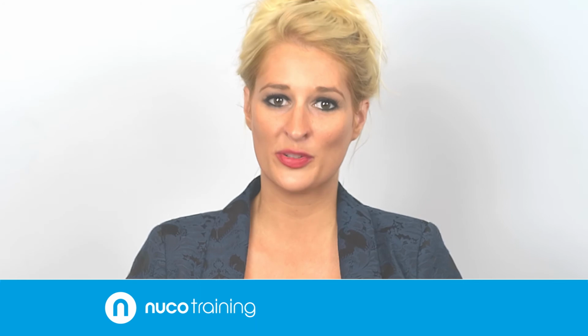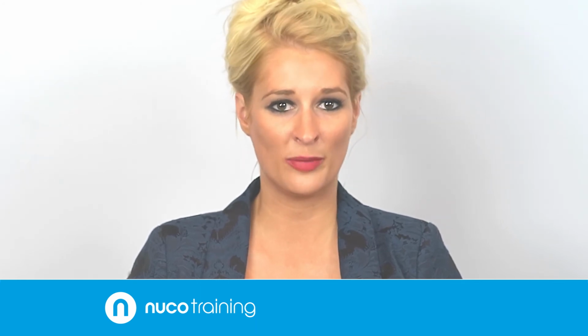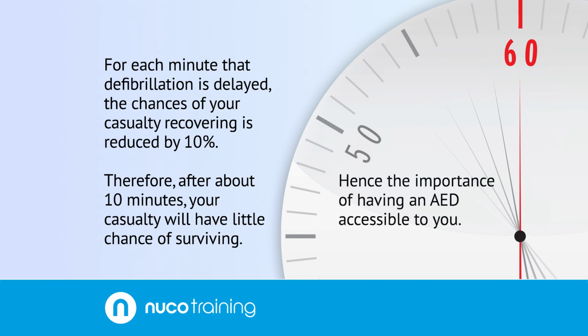Automated external defibrillators, AEDs, will only shock the casualty if VF is present, or if its precursor is present, ventricular tachycardia, which results in a very rapid heartbeat. For each minute that defibrillation is delayed, the chances of your casualty recovering are reduced by 10%. Therefore, after about 10 minutes, your casualty will have little chance of surviving, hence the importance of having an AED accessible to you.